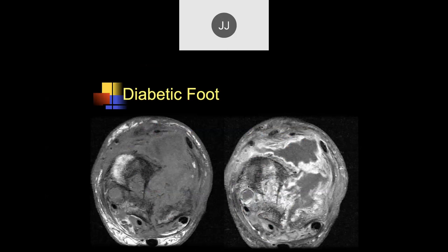Here's another example on T1-weighted images where it looks like phlegmon — it's hard to tell how much is abscess versus phlegmonous tissue. When you give contrast, you can clearly see that there's a huge amount of pus collection within the soft tissues.